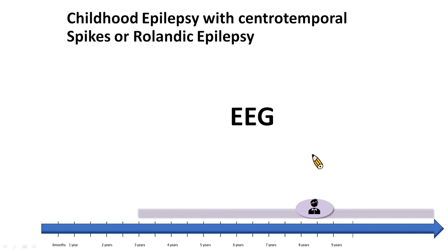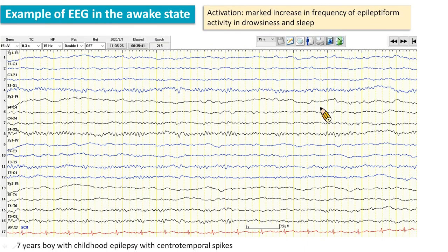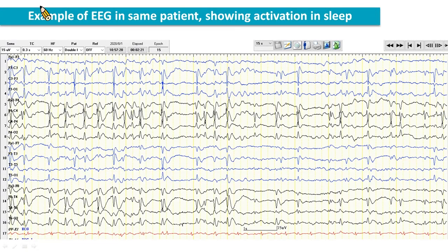Let's see the EEG. The background is normal. As seen in this EEG, there are simultaneous maximum negativity in central temporal electrodes and maximum positivity frontally, which is considered as horizontal dipoles. The next slide shows epileptiform discharges enhanced in sleep. This awake EEG shows a normal background with no epileptiform discharge. The sleep EEG of the same patient shows frequent epileptiform discharges over bilateral central temporal areas.